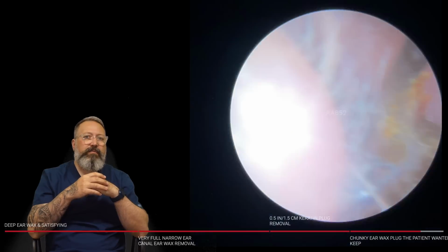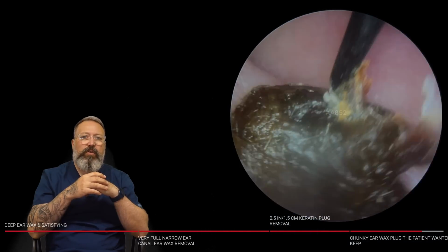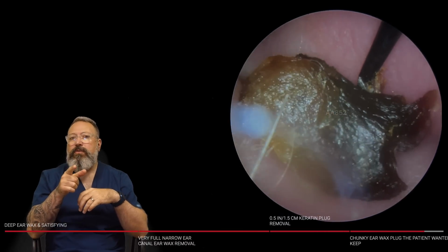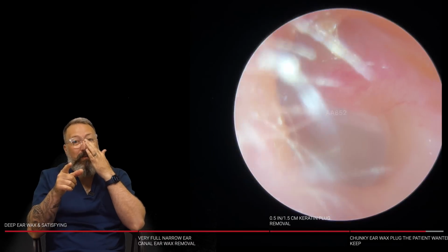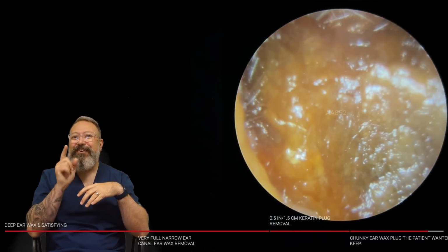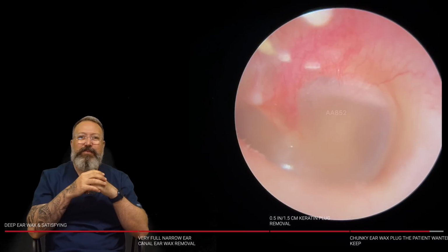So looking absolutely fab there. Big plug, all came out in one piece. Let's take a look. I don't think I've got a ruler shot on this one, only because the patient took the wax home with them to show their wife. So that's the reason there's no ruler shot. But this is what it looks like after. As you can see, it looks much, much healthier there.